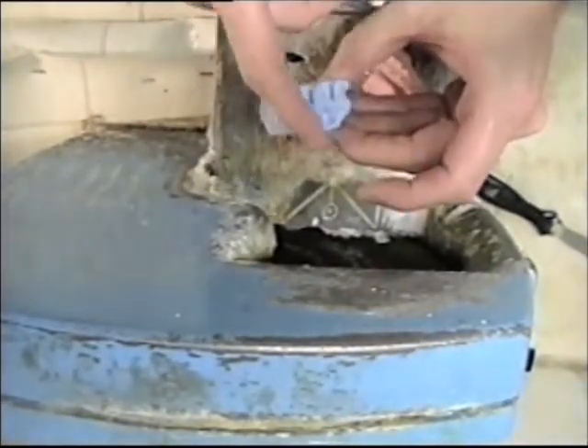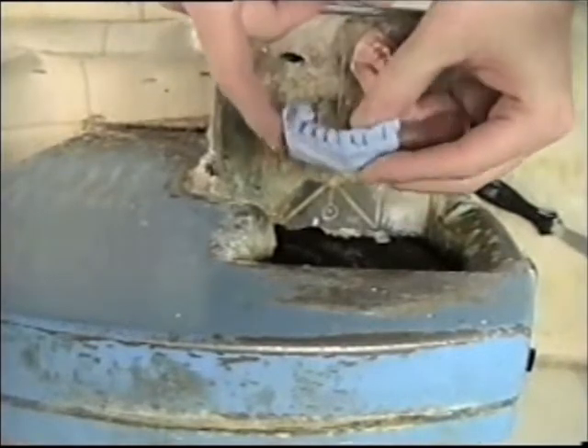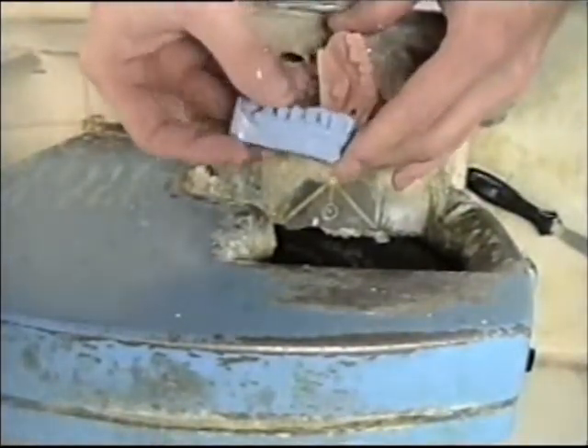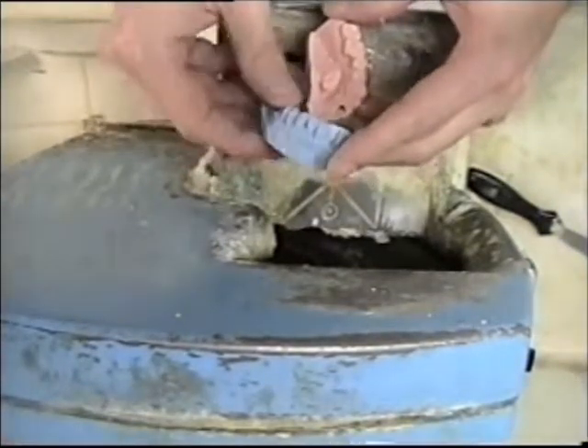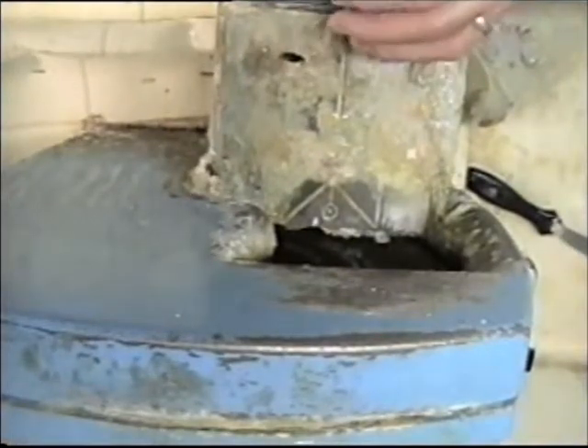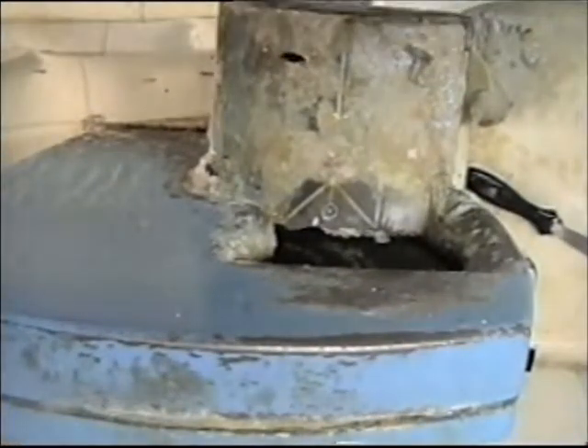I also trimmed off this excess here and just tried to trim it up, make it look as neat as I can for right now. We'll do the same thing on the next two that I have.